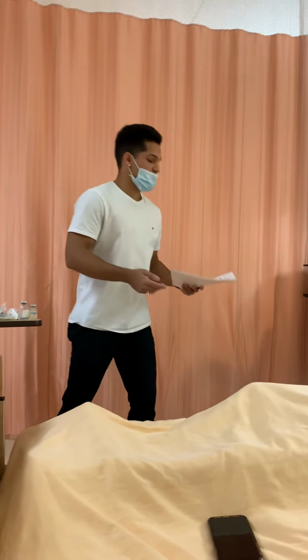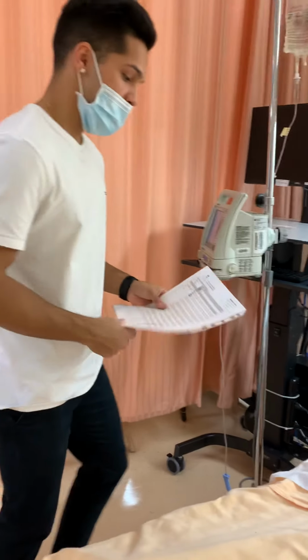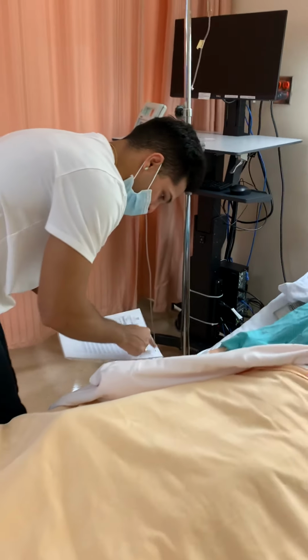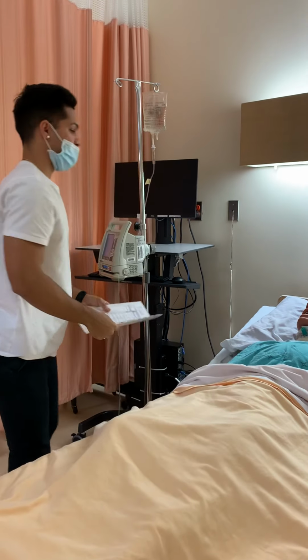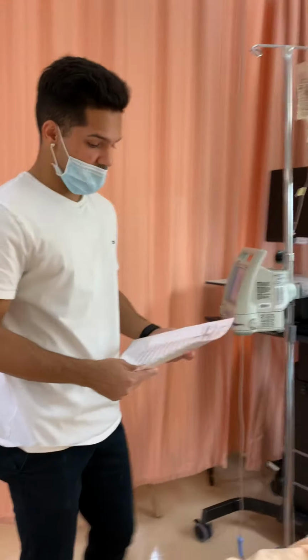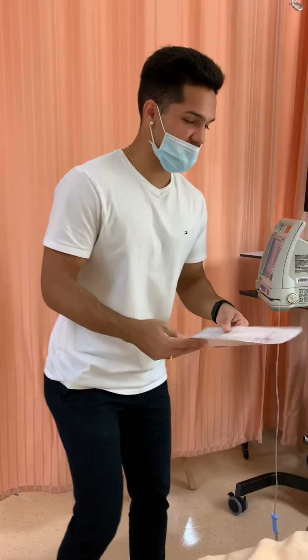Hi, my name is Mohammed Kaushal. Today I'm going to be your student nurse, and before I start, can I just verify your ID with your armband? Okay, perfect. Ricinema, PIN is 123456, 79, October 20th, 1990, no known allergies. Could you please tell me your full name and date of birth? Ricinema, October 20th, 1990. Okay, do you have any allergies? Patient says he has no allergies. Okay, that's exactly what we have over here. Okay, Mr. Wrightson, I'll be right back.